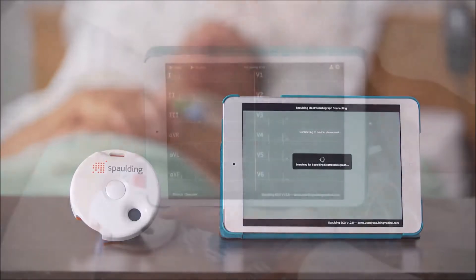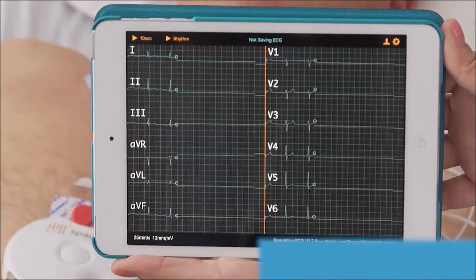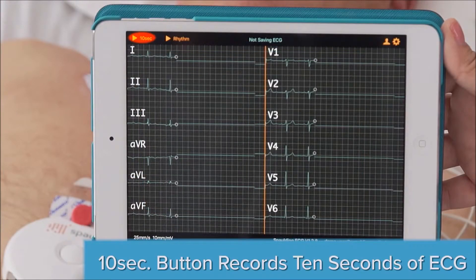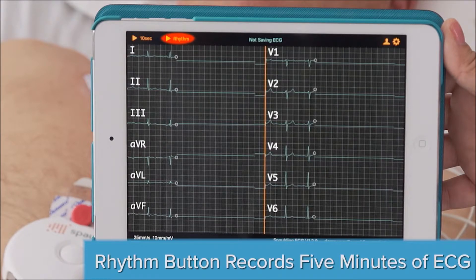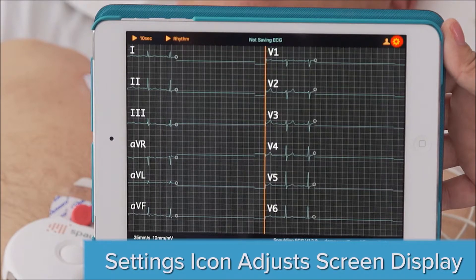In the upper corner, you will find a 10-second button and a rhythm button. The 10-second button allows you to record 10 seconds of an ECG. The rhythm button allows you to record up to five minutes of an ECG. The settings icon allows you to adjust the display on your screen.